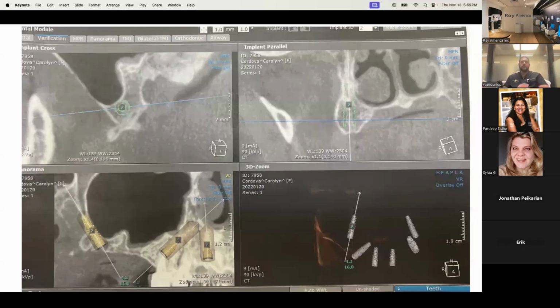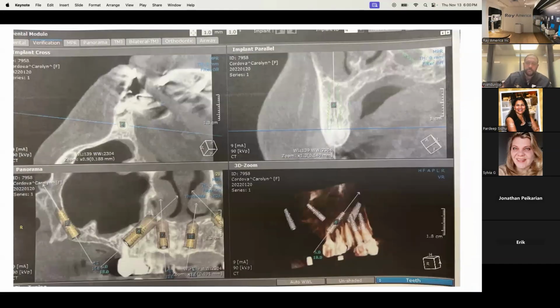So looking a little bit more deeply into the CBCT, I'm able to really place the pterygoid implant into the tuberosity bone, and then I'm able to angle it and kind of see in cross section where my anatomy is. So in this case, I'm using a 16 millimeter implant, and you can appreciate how dense the bone gets as I get to the apex of the implant. It's much wider and brighter, and that's a good sign. That means that as I put my implants into position, I'm going to have an increasing insertion torque.